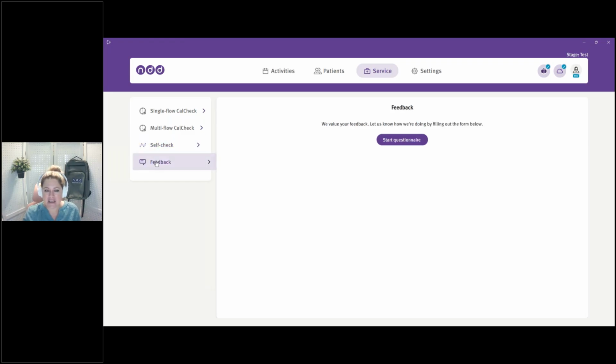And then last but not least, feedback questionnaires. This is a new product to the market for us. So any feedback from customers or people using the devices is very, very valuable to our team as we continue to develop this product.